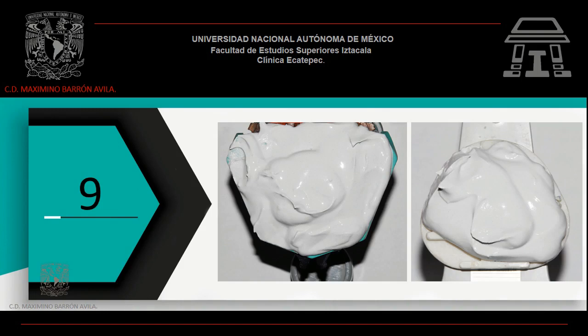A través de un registro con arco facial del paciente, posiciona el sistema ACUTRAC en el articulador. Coloca yeso tipo 2, coloquialmente conocido como yeso blanca nieves, en la parte del sistema ACUTRAC y a la vez en la platina de montaje del articulador. Cierra tu articulador. Verifica que los dos yesos de las dos porciones que has colocado tengan contacto.